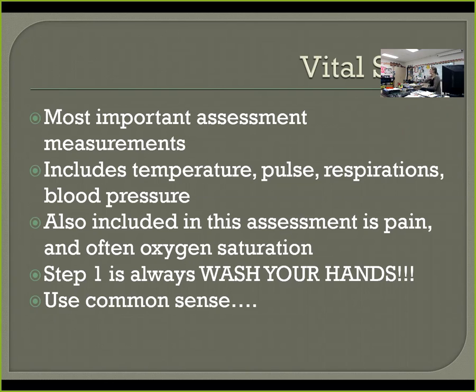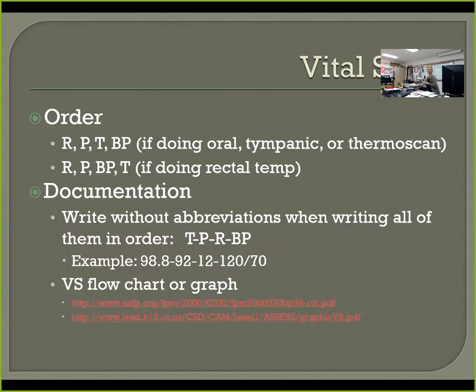Step one of any vital sign that we're going to do, any procedure that we're going to learn, is always going to be wash your hands. Makes sense. Okay. So the order in which you take vital signs are those four.